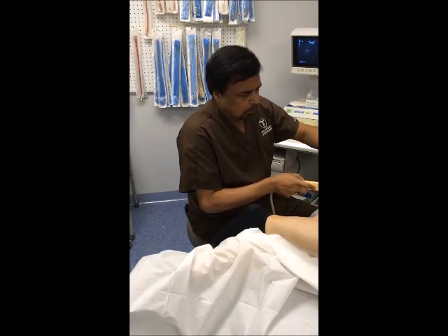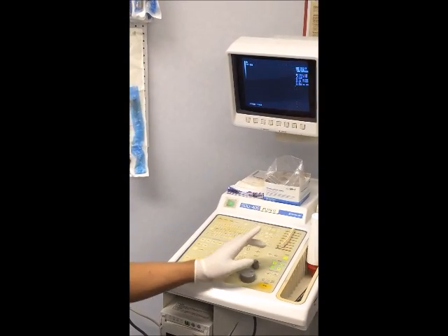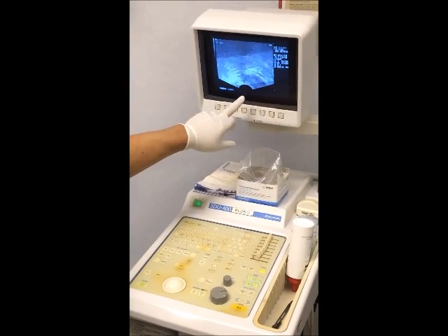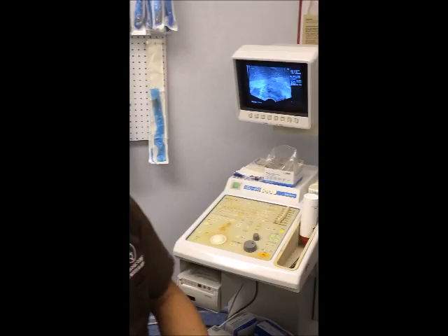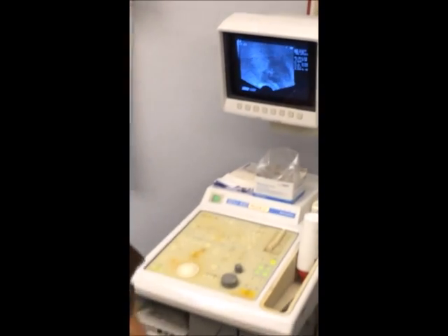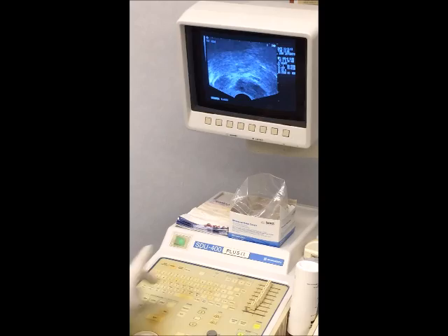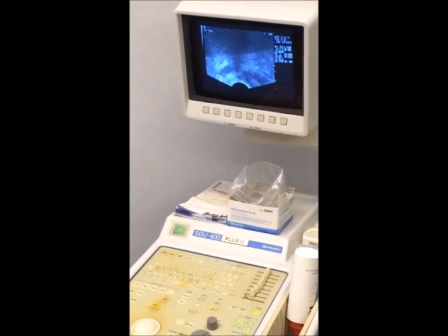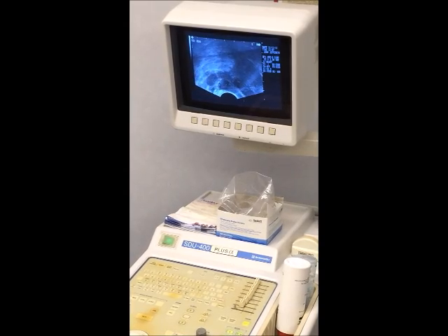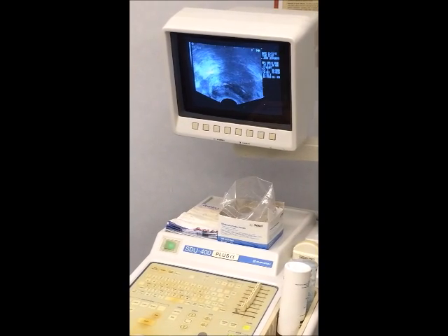I'm going to do the prostate block as usual. That is the seminal vesicle, that's the prostate, and I have the local anesthetic. I call this the Mount Everest sign right here, between the seminal vesicles and the prostate. My needle goes there and I inject some local right there — you can see that area becoming black. Then I inject 10cc of 1% xylocaine and the block is in place.